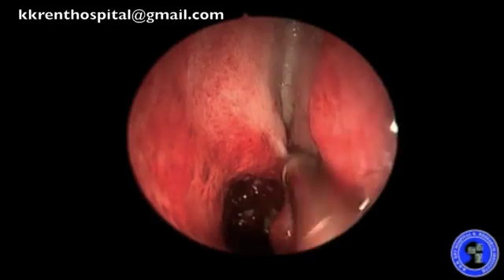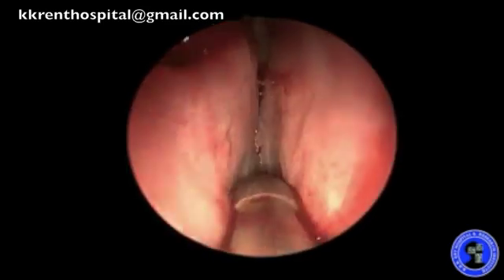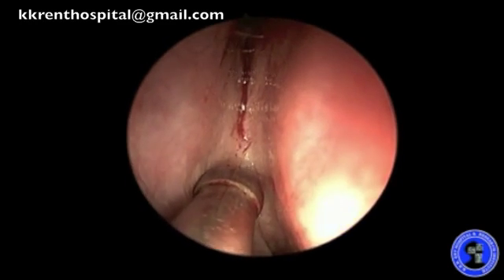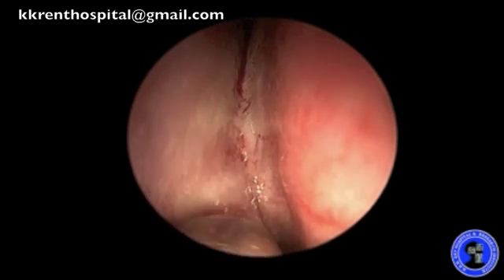On removal of the pack, I have very good visibility of the skull base, both medial to the middle turbinate and if required, medial to the superior turbinate all the way to the sphenoid sinus.